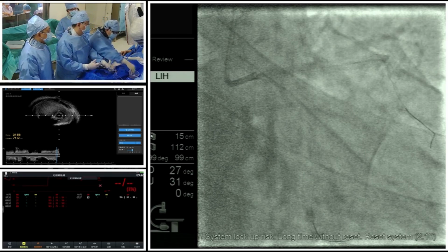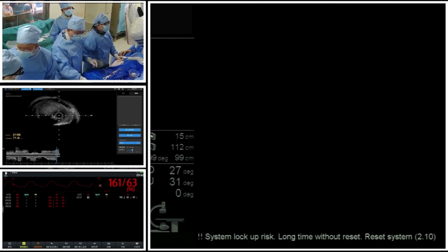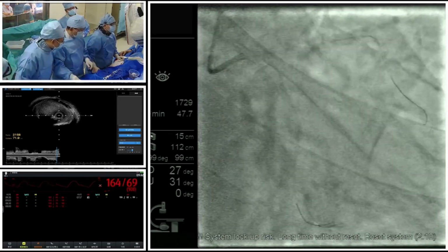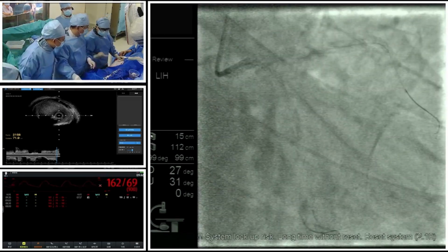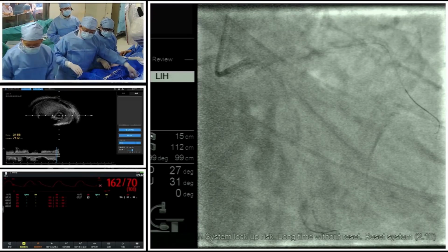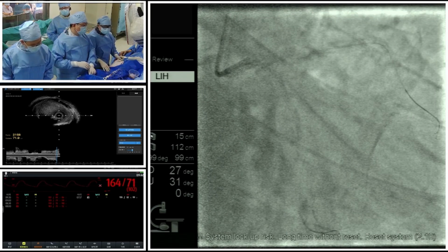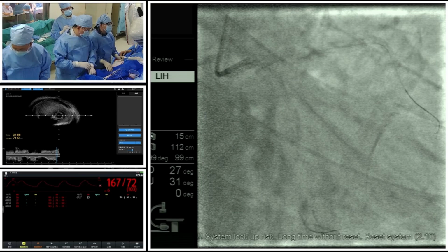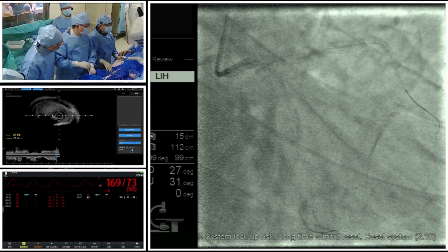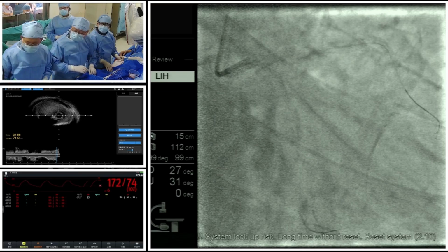Yeah, you're right. I think nowadays there's a transition in the pre-treatment of calcification. Before, I think we took the debulking strategy. That's why the ratio should be bigger, maybe 0.6 to 0.8. But right now the idea has changed to modification. So we should choose a smaller burr just to modify the calcification, and then we can use some other techniques to better treat the calcification. Yeah.